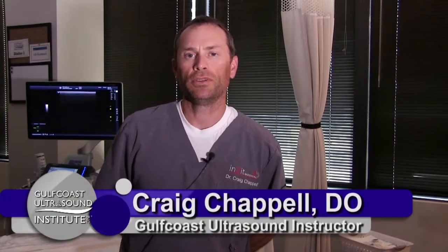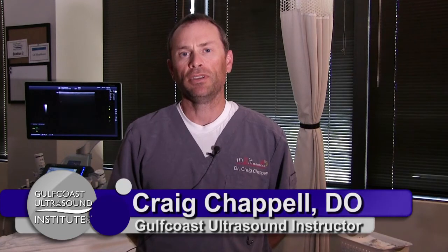Hi, I'm Dr. Craig Chappell with Gulf Coast Ultrasound with your hot tip of the day. Today I'm going to show you how to do a knee injection from the suprapatellar approach from the lateral side, which can be sometimes difficult with a dry knee, but I'll show you how to basically isolate the needle and the structures in that region.